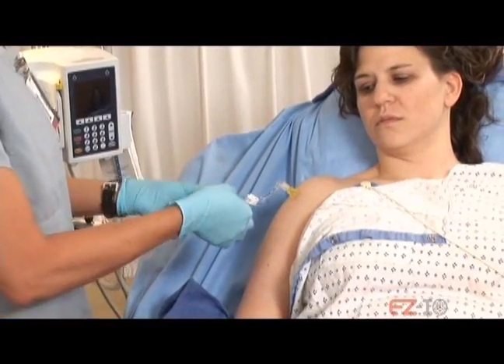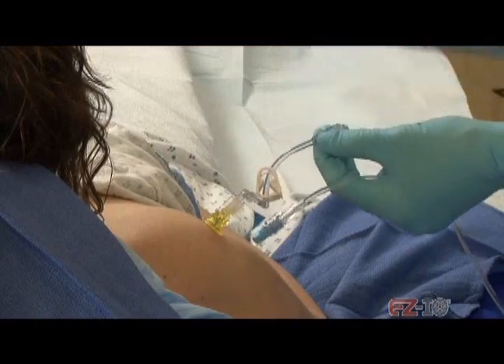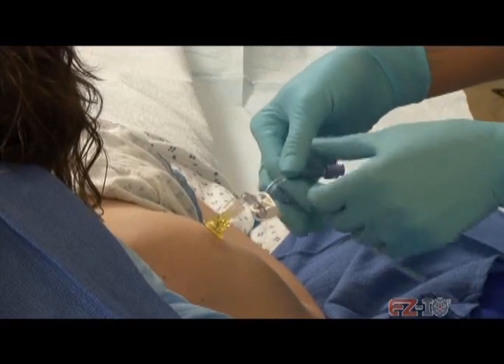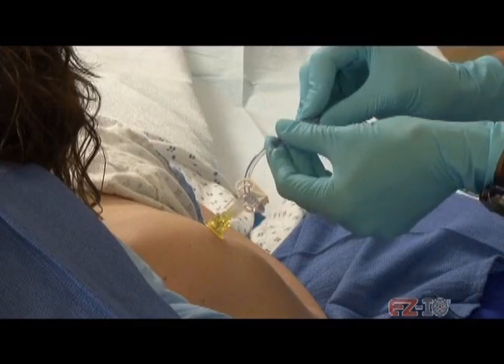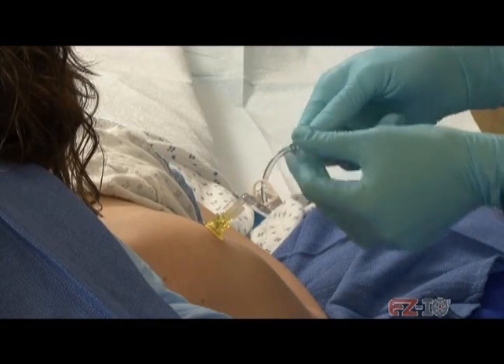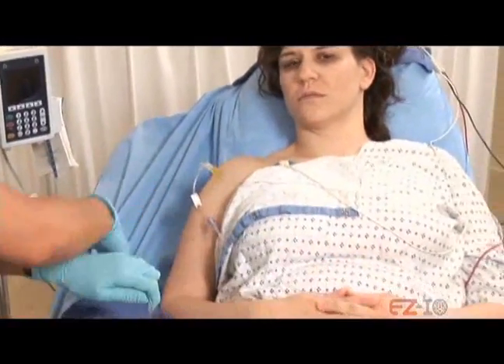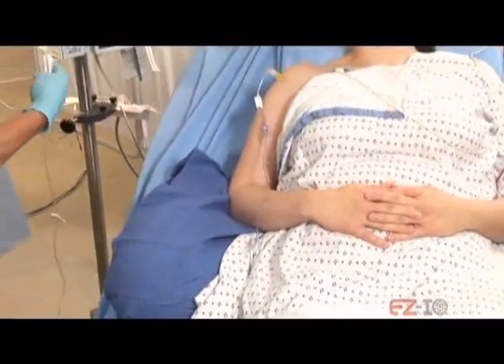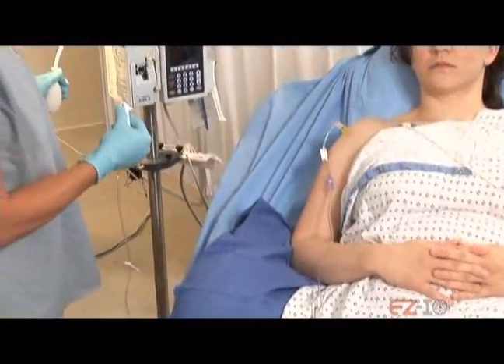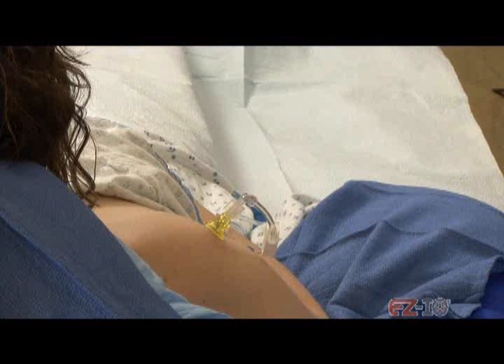The pressure in the medullary space is approximately 1/3 of the patient's mean arterial pressure. This is important to remember because the pressure outside the bone in the IV bag must be higher than the pressure inside the bone to achieve flow. Therefore, fluids or medications must be delivered under pressure to obtain maximum flow rates. Rapid fluid infusers can be used for aggressive fluid resuscitation. So I'm just putting a little pressure on that fluid.